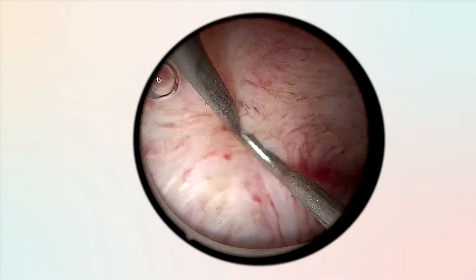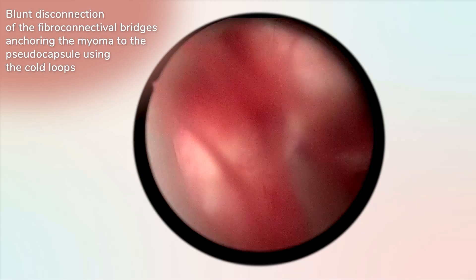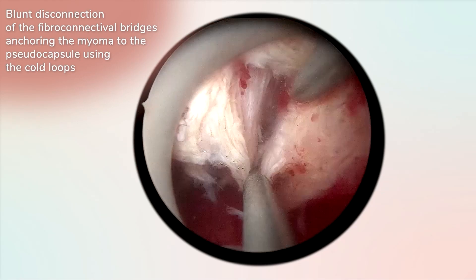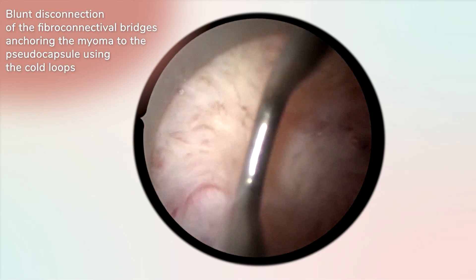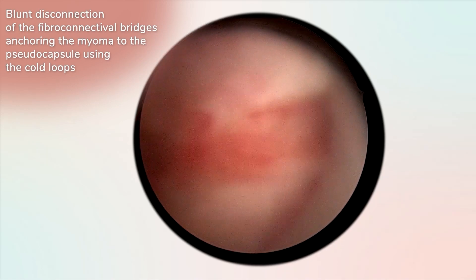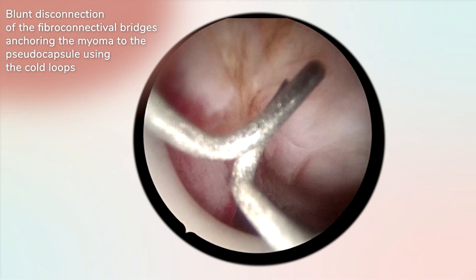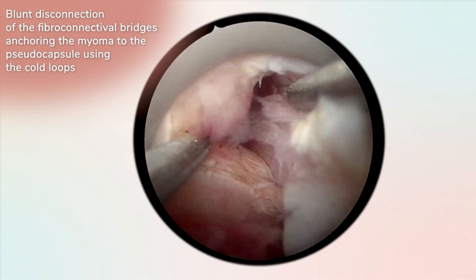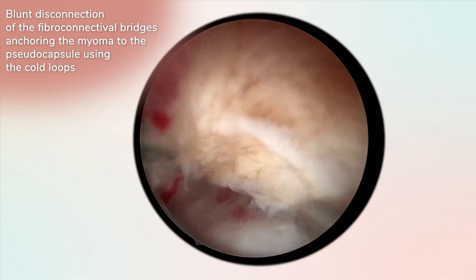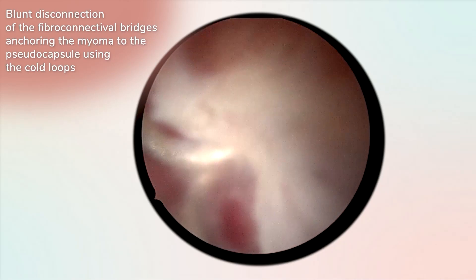Next, the electrical cutting loop is replaced by the flat cold loop, which facilitates the accurate and easy identification of the cleavage plane between the myoma and the myometrium. To effectively bluntly disconnect the fibro-connective bridges anchoring the myoma to the pseudo-capsule, the hooked cold loop is applied by making repeated passages along the surface of the myoma.